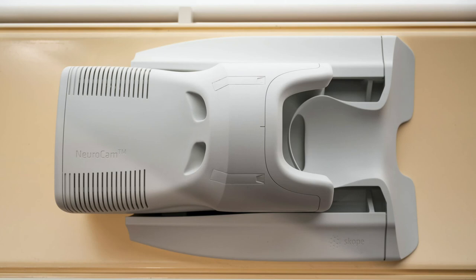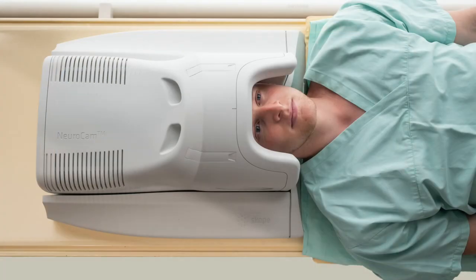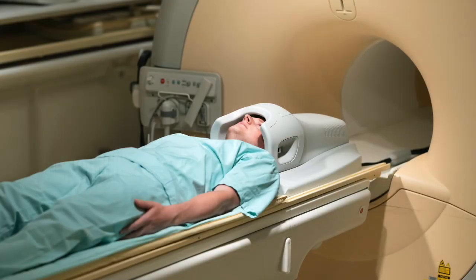The NeuroCam and Scope Eye, in turn, are providing image detail and consistent image data sets to people who request best available MR imaging performance for their research. I hope you enjoyed this demonstration. Feel free to reach out if you have questions at any time.